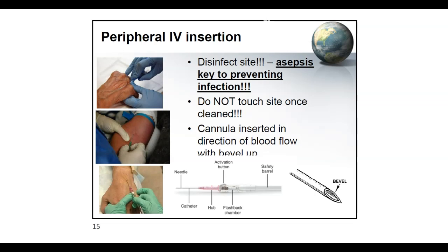So make sure that you're able to palpate, and be very careful. If there's a better vein, choose that one. Look at the more straight, bigger one, and again, take into consideration the site. Does the patient move a lot? Is that going to stop the infusion whenever the patient is moving?